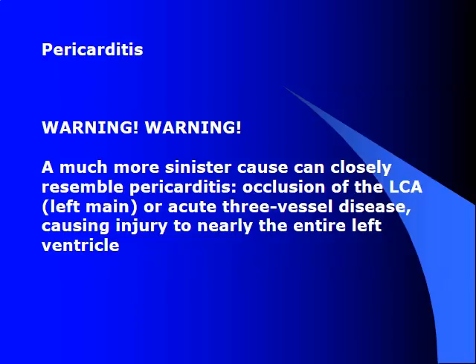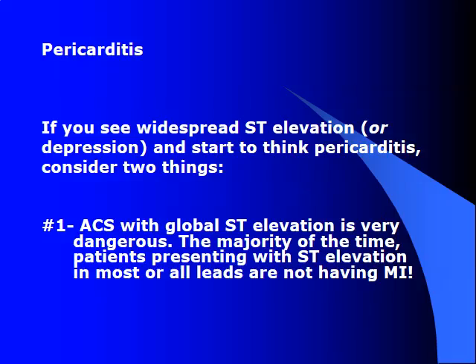There is a much more sinister cause that can closely resemble pericarditis, and that's an occlusion of the left main coronary artery, or acute three vessel disease, which causes injury and death to nearly the entire left ventricle. So if you see widespread ST elevation or depression and start to think pericarditis, consider two things. Acute coronary syndrome with global ST elevation is very dangerous. This is a very high mortality injury.